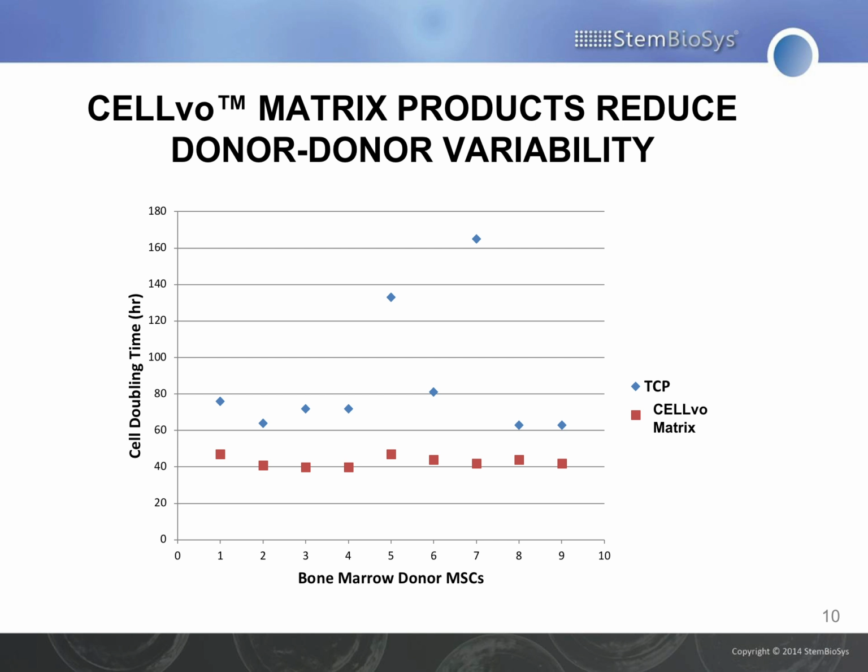They're waiting for a signal, which hopefully is going to be added by the researcher, as opposed to the cells reacting to their environment prior to experimental protocols taking place. So we're getting more rapid proliferation, and we're seeing more consistent results from donor to donor.